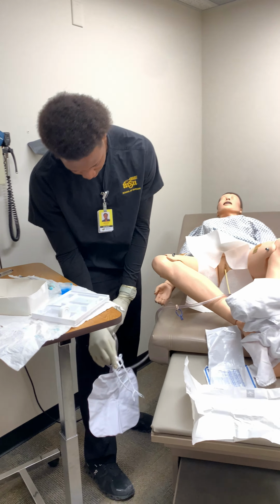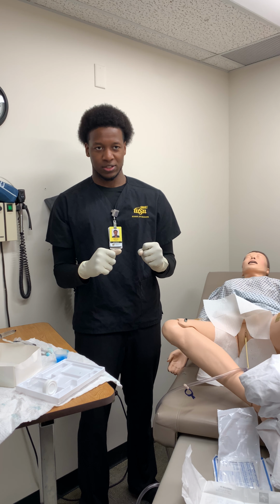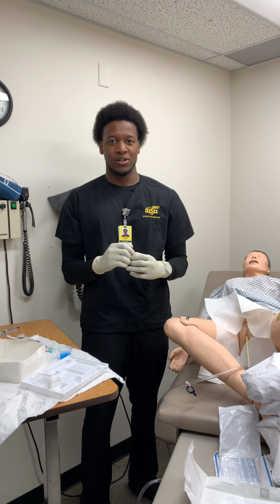After doing all that, I'll make sure I clean this patient up, get the patient back comfortable, give the call bell light to the patient, and see if the patient has any questions. I will lower my bed back down to the lowest position, take my gloves off, make sure everything is clean once again, and foam out. Thank you.